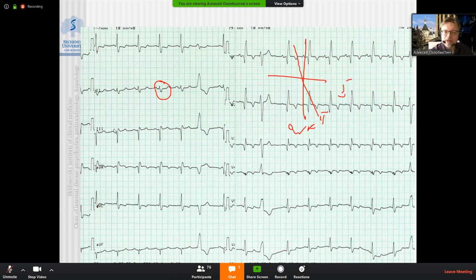So if we presume that the axis of the heart is perpendicular to second standard lead, it should either coincide with the positive part of AVL or go in the opposite direction. So in AVL, it should be either tallest positive or deepest negative. It's positive. And in that case, I would say that the angle alpha should be close to minus 30. It's a horizontal axis; still it may be normal, but close to deviation to the left.